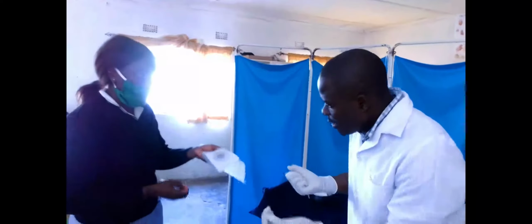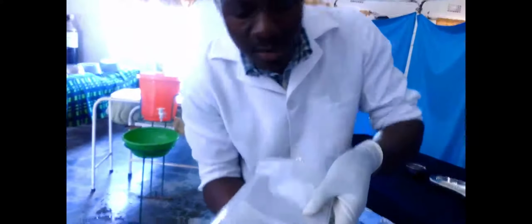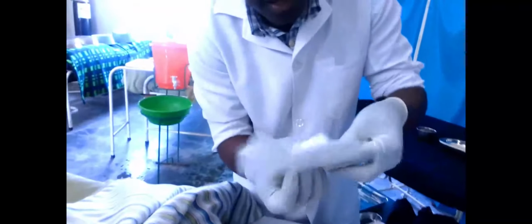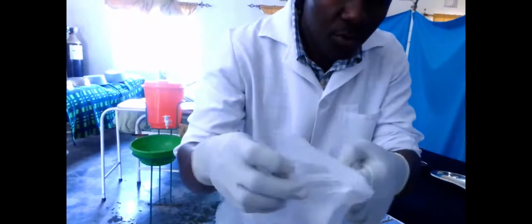After having given this, you're supposed to just poke it. You poke it like that and pull. Or some people just do that from this other side, but then you can't see it through, so I need to do that so that you have this part here. Then since the drainage should be going this other side, you have to place it like this. This hole here is supposed to be there.